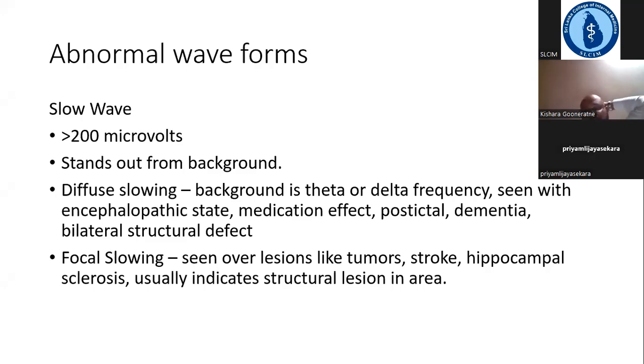We might see some occipital lobe slowing in diffuse Lewy body dementia. So depending on the dementia, the theta to delta activity might be fairly regional as well. But as the dementia progresses, the activity can become diffuse, right?